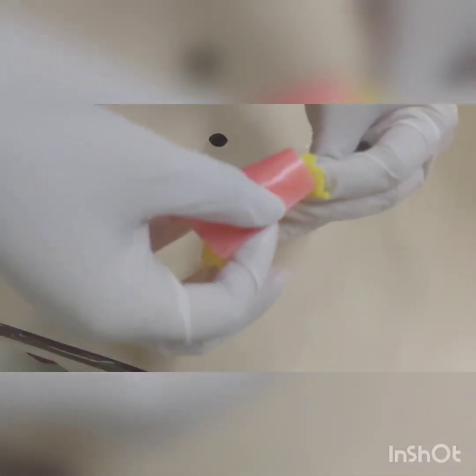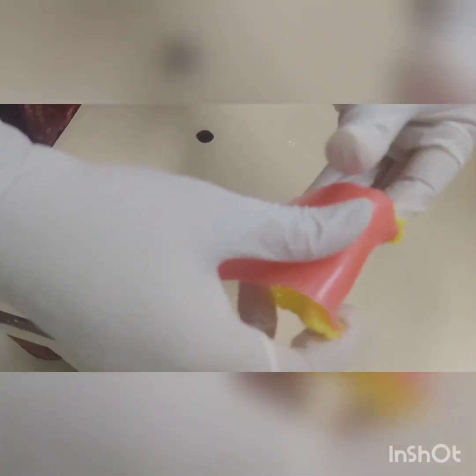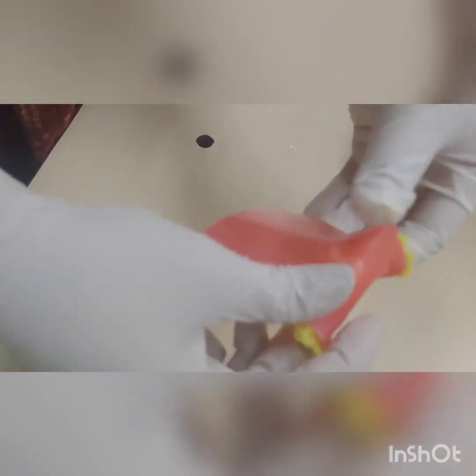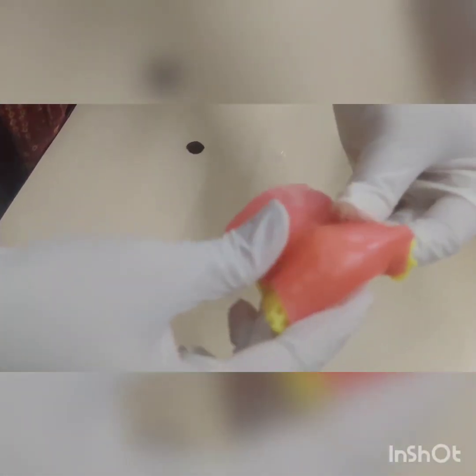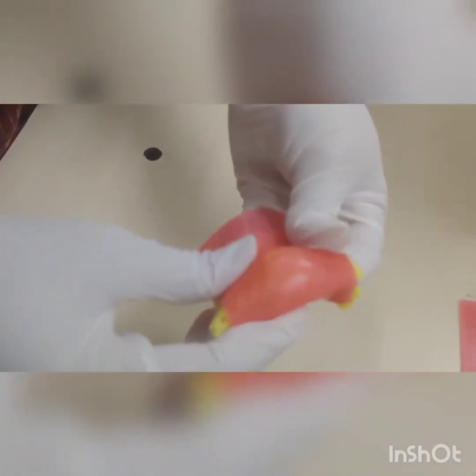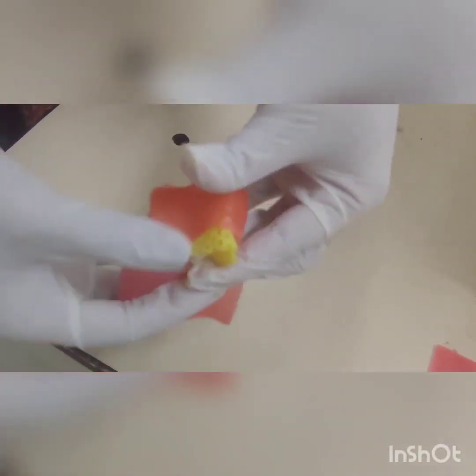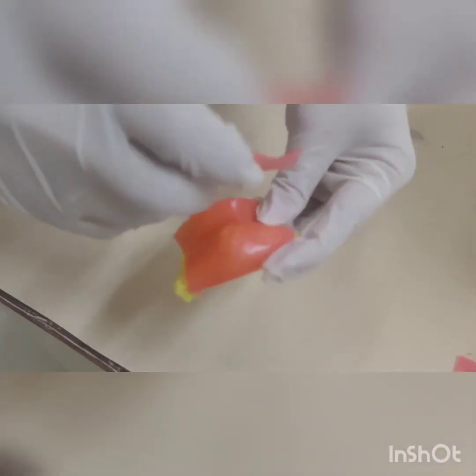Then wrap and cover it with dental wax. You can see this is smooth wax — it can cover it properly. You can see how they make it, and any remaining parts you can cut. This is the dental wax.